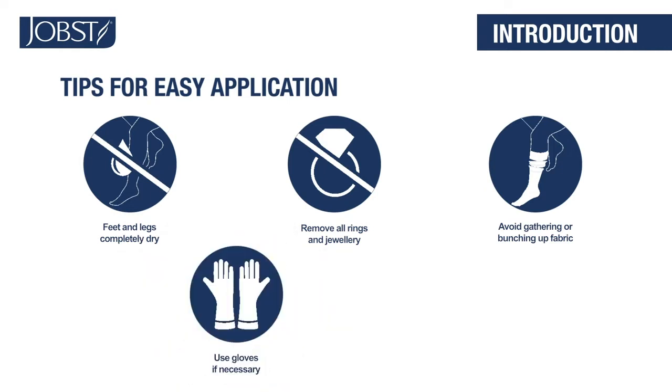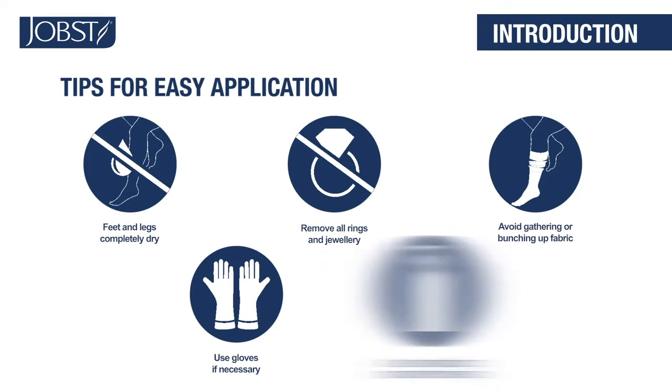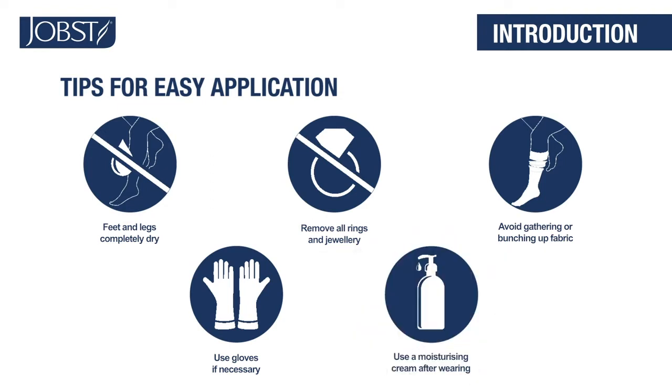If you prefer, you can use gloves to help create friction and provide a better grip. Use a moisturizing cream after you take off your JOBST hosiery to keep skin moisturized and healthy.